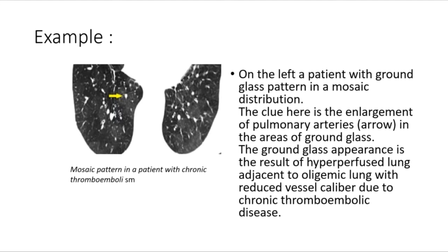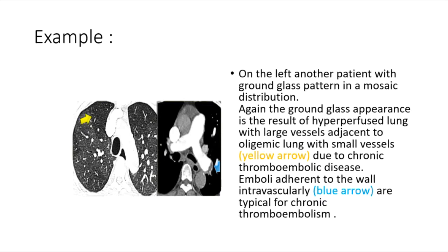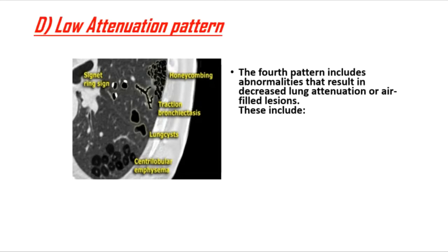A patient with ground glass pattern in mosaic distribution shows enlargement of pulmonary arteries in areas of ground glass — the result of hyperperfused lung adjacent to oligemic lung with small vessels (yellow arrow) due to chronic thromboembolic disease. Another patient shows the same mosaic pattern with large vessels adjacent to oligemic lung with small vessels. Emboli adherent to the vessel wall intravascularly (blue arrow) are typical for chronic thromboembolism.